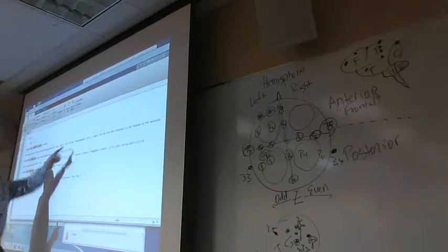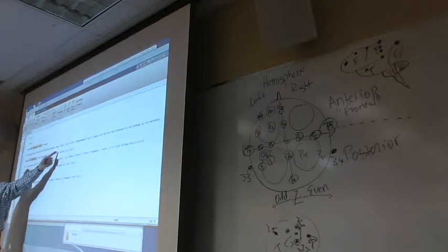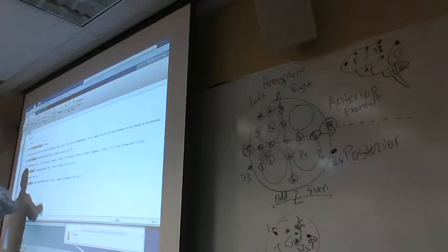What do we mean by a string? When the computer reads this, it just reads it as letters, not as numbers, and they call letters and words strings of letters. So in MATLAB language, strings or letters are processed differently than numbers. Basically, just trust me on it.